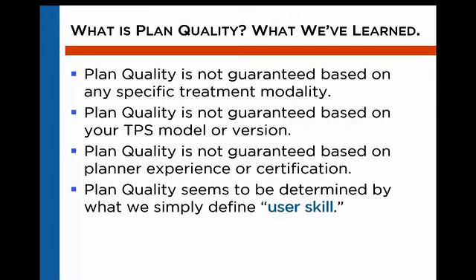So that if you use a certain treatment planning system and a delivery modality, and you're not real happy with your plan score, we'll give you access to the people who excelled with your same profile of equipment, so that you can learn what their tips and tricks and techniques were, so that then you can try that in your own clinic.